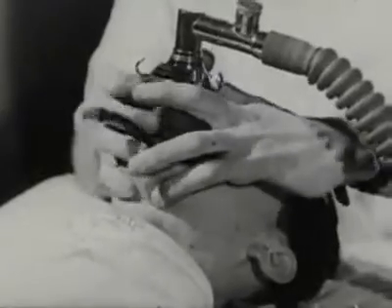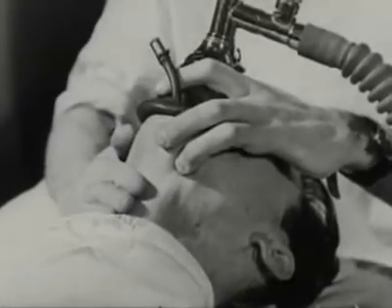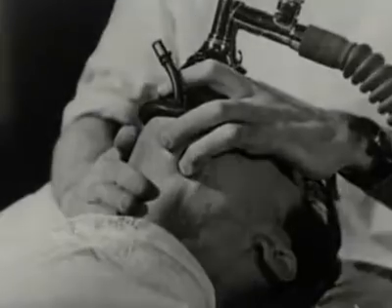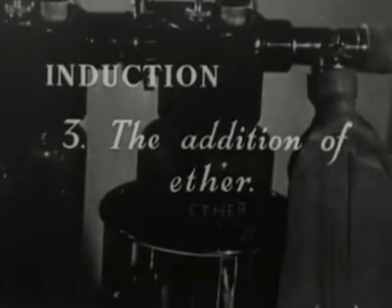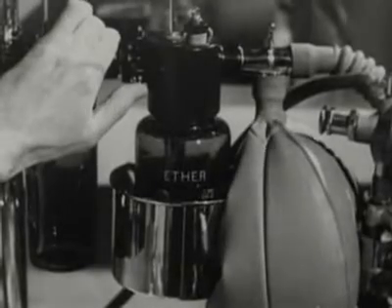Keep the chin well up, and if you put your hand on the patient's throat, you'll be able to feel the vibration of an obstruction that may not be obvious to the ear. Turn on the ether tap a little every 3 regular breaths.